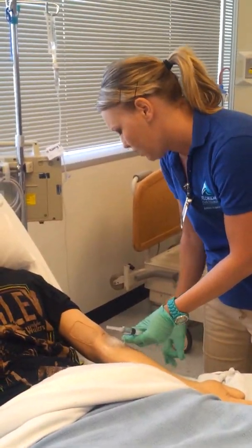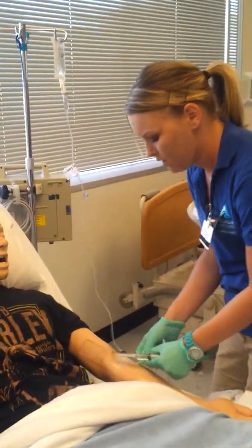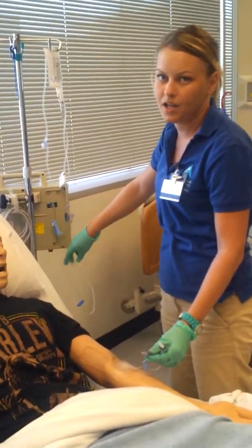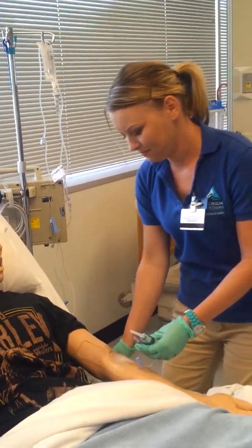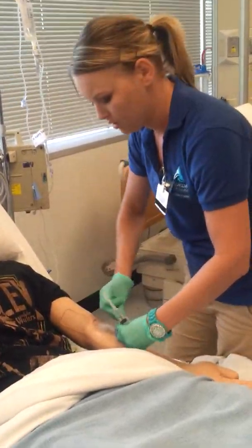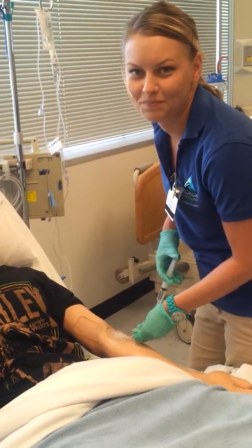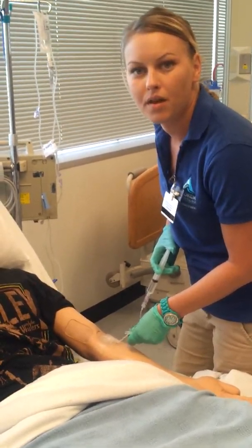So I would go ahead and stop this IV antibiotic. I would close the IV line and disconnect. I would recap this and hang it for somebody else to use at a later date as long as the tubing was still good. I would get some alcohol and clean this. Again, if this was a PICC line, I would be using the SASH method and after I administer the saline I would administer heparin as well. I'm going to flush his IV with 3mL of saline with a push-pause method — pushing about half a milliliter with every push — and then clamp it while there was pressure on the plunger.